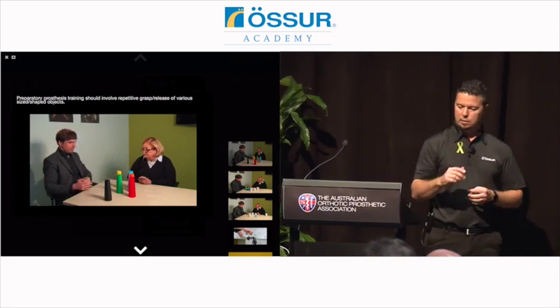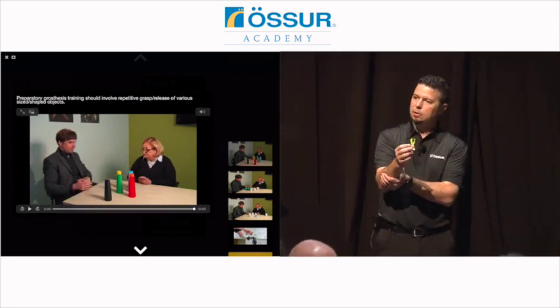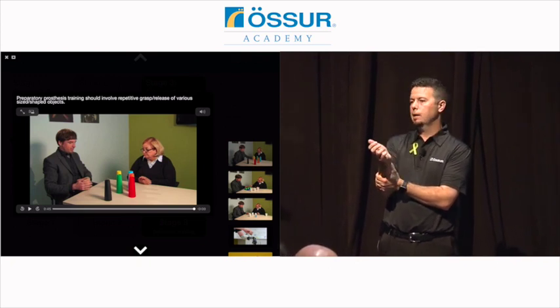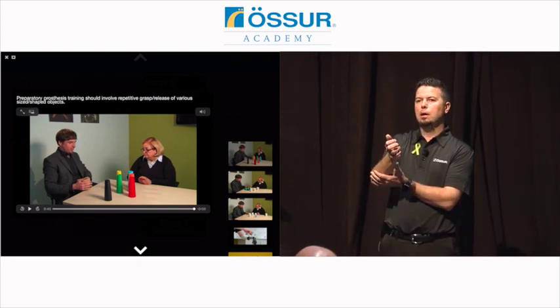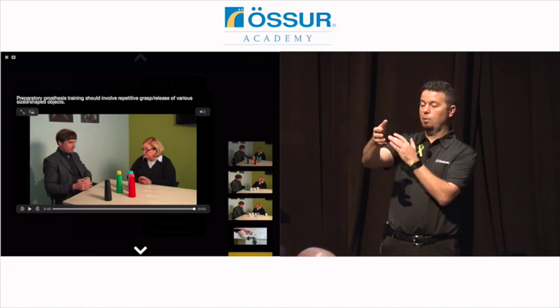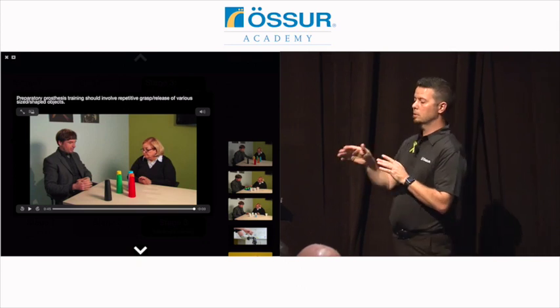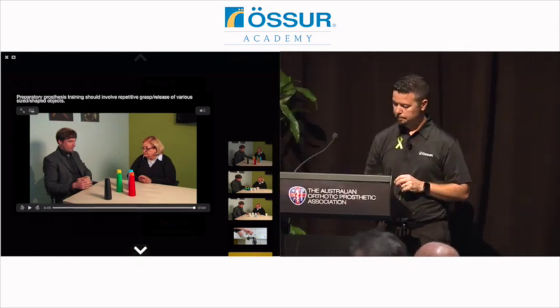If you've ever had a user that kind of supports their arm as they're trying to control it, that's a telltale sign that maybe they're working harder than they have to, or are they losing contact or inability to support that weight and relax their muscle signals in space when they're using it. So this is a good way to test that out.